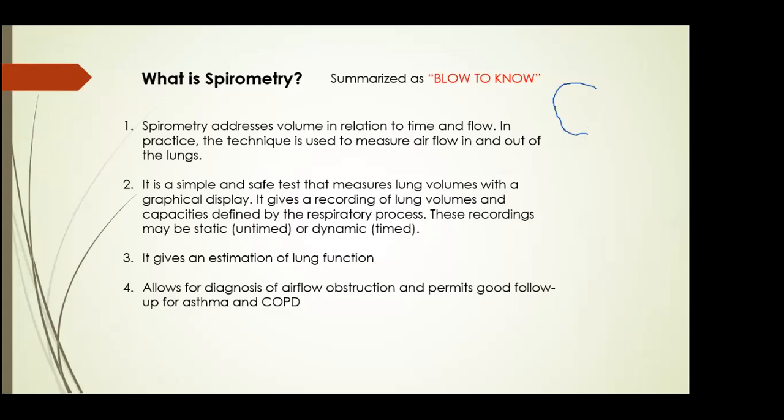So if this is your face there, and you have your mouth there, whatever you blow out is what can be captured by a spirometer. So if you blow out so much volume, that is expiratory volume because you have taken it out.